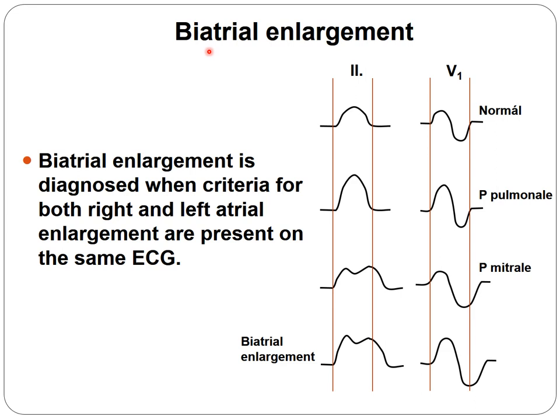We can have biatrial enlargement when both the right and left sides are enlarged. In this case, both criteria for right and left atrial enlargement are present. In lead II we have a taller and notched P wave, while in V1 both the initial and terminal phases are deeper and the overall wave is wide.